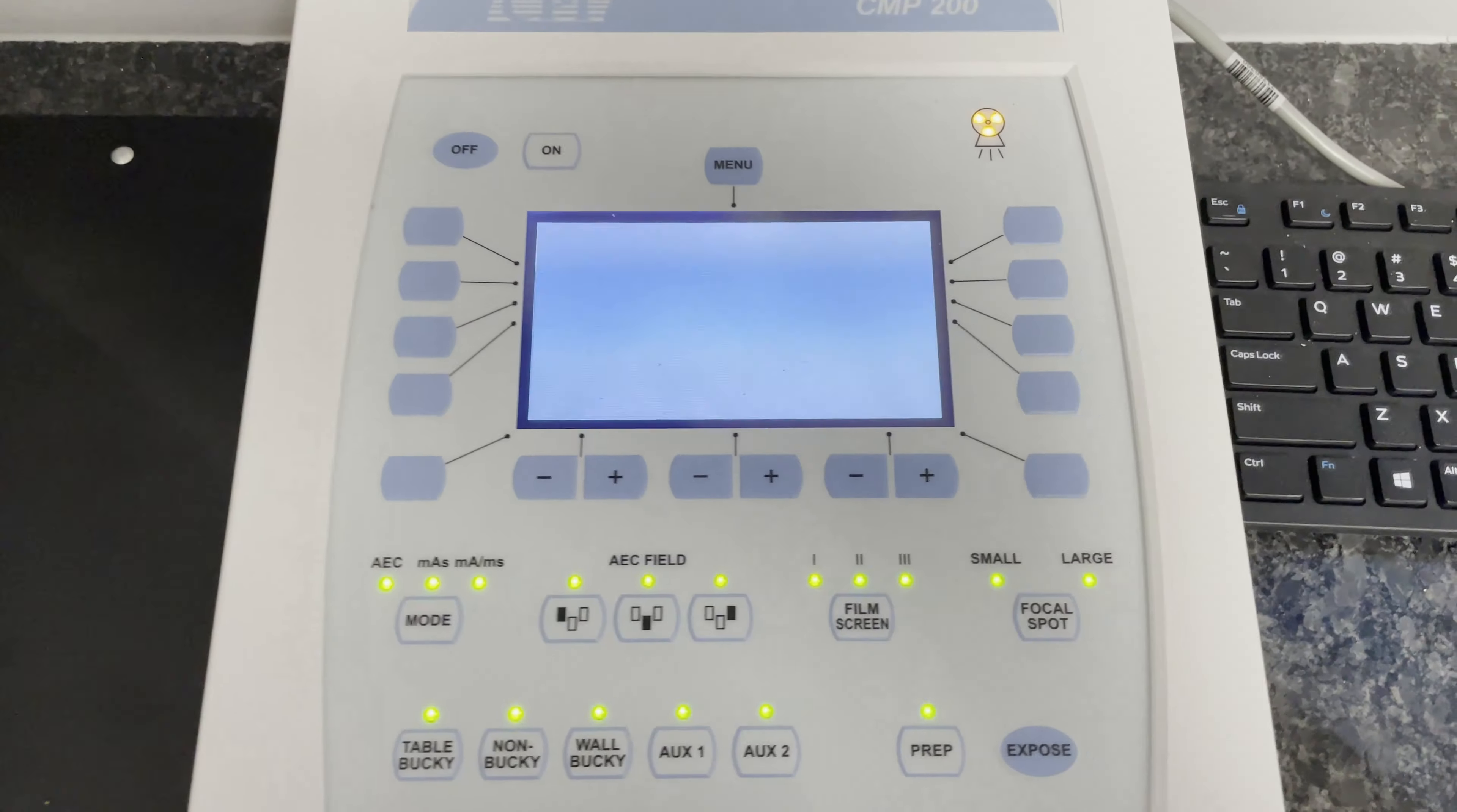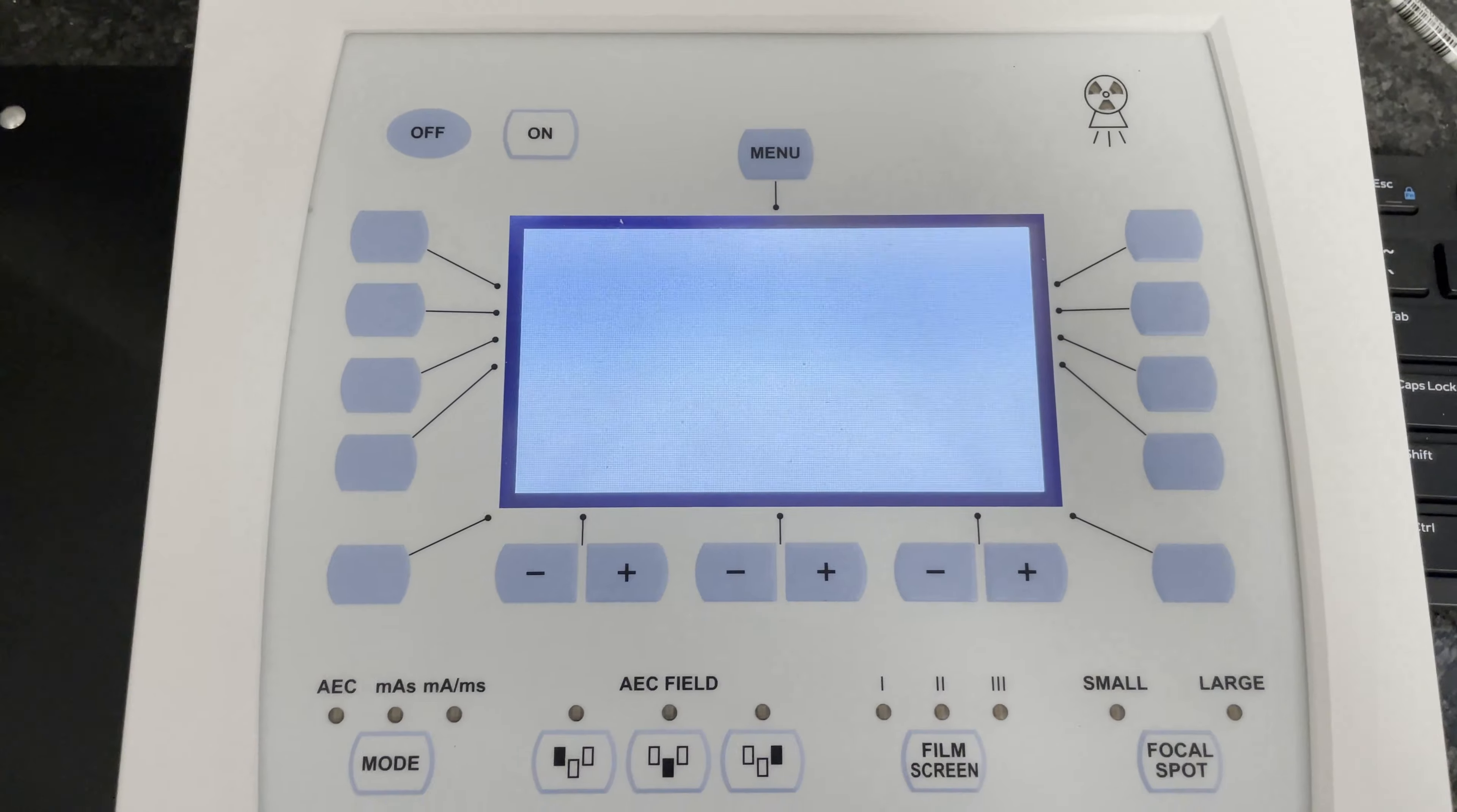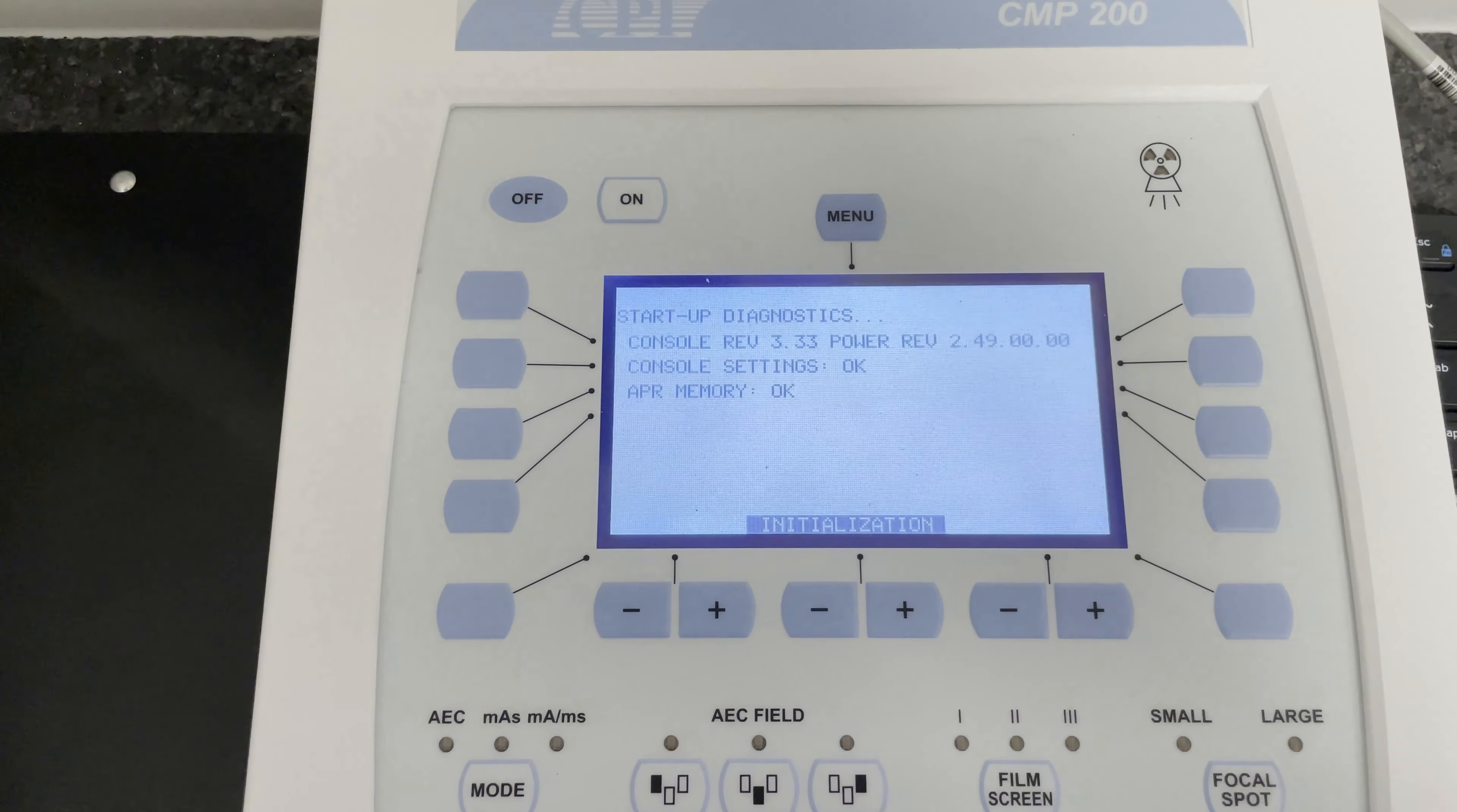You're now going to see it go through its initial calibrations and you're going to wait for it to go through these before getting started with an x-ray.